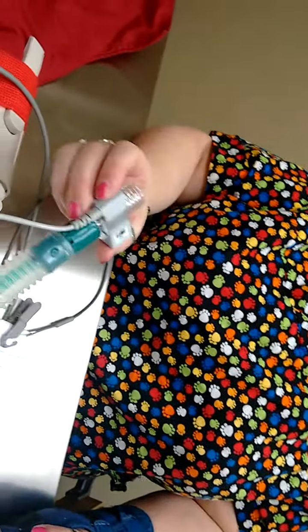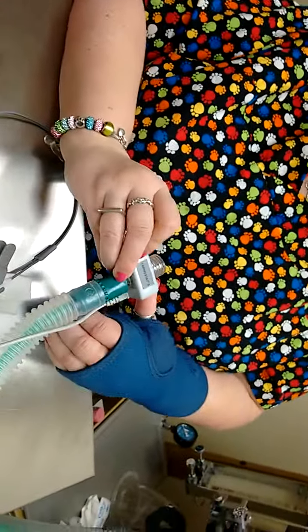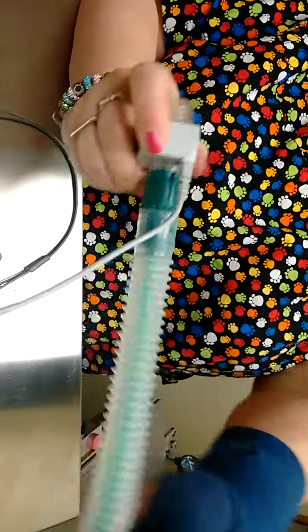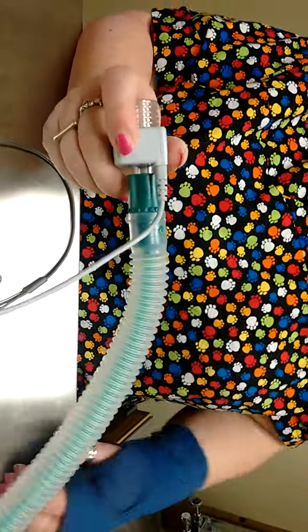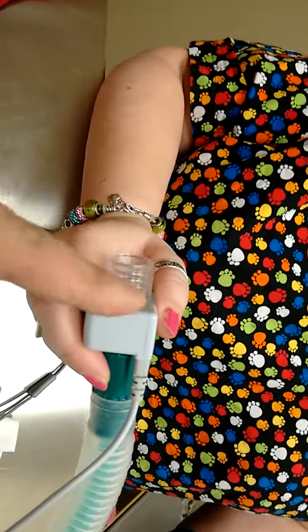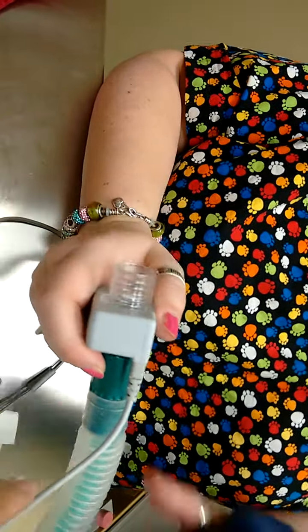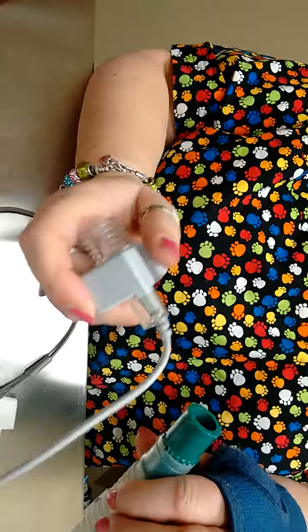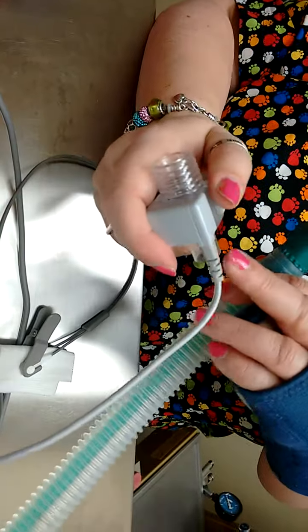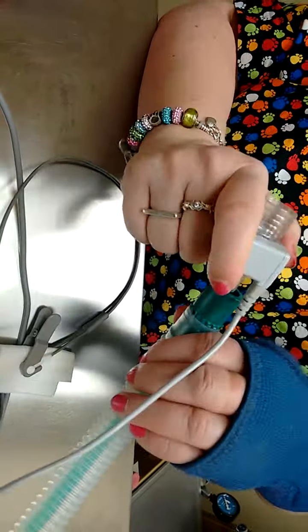What about this one? This is the capnograph. This one has to be hooked up to your ET tube, your endotracheal tube, from this side and the gas. It always only goes one way, remember? Because the ET tube is small, this one's small, it goes in. There's only one way you can do it. You can't screw it up.